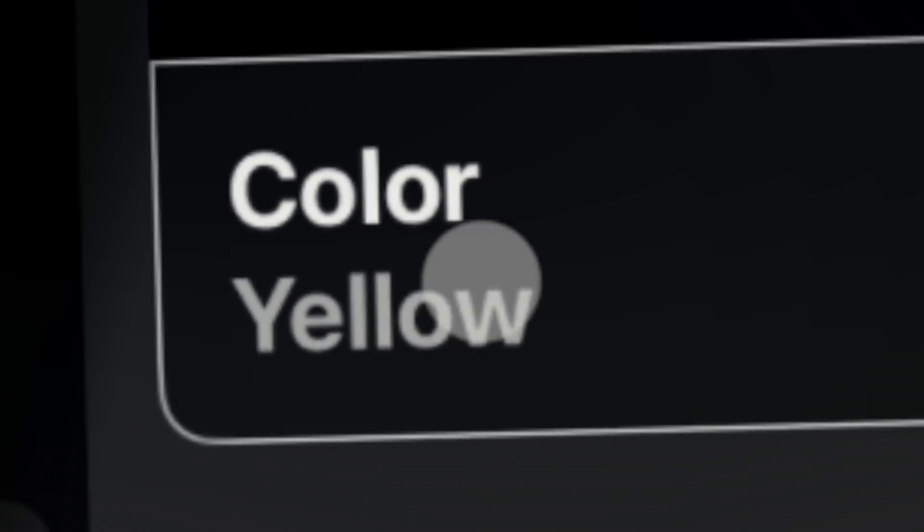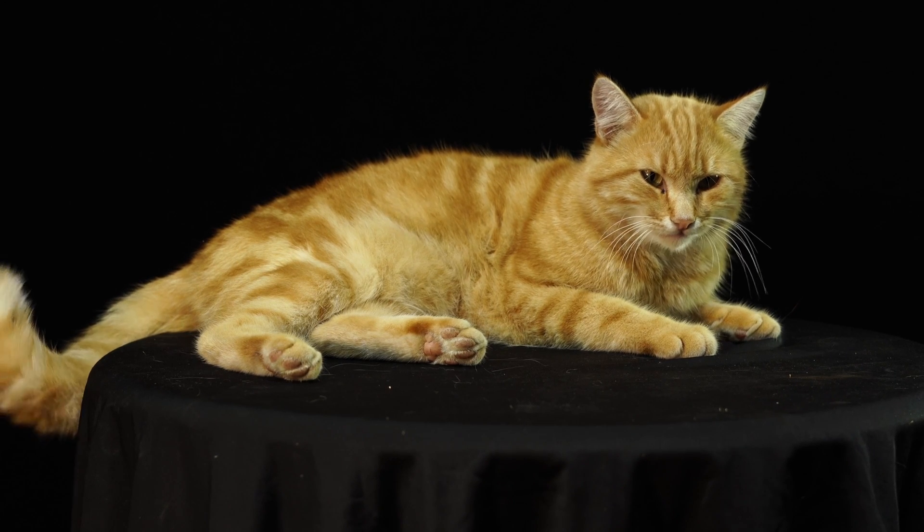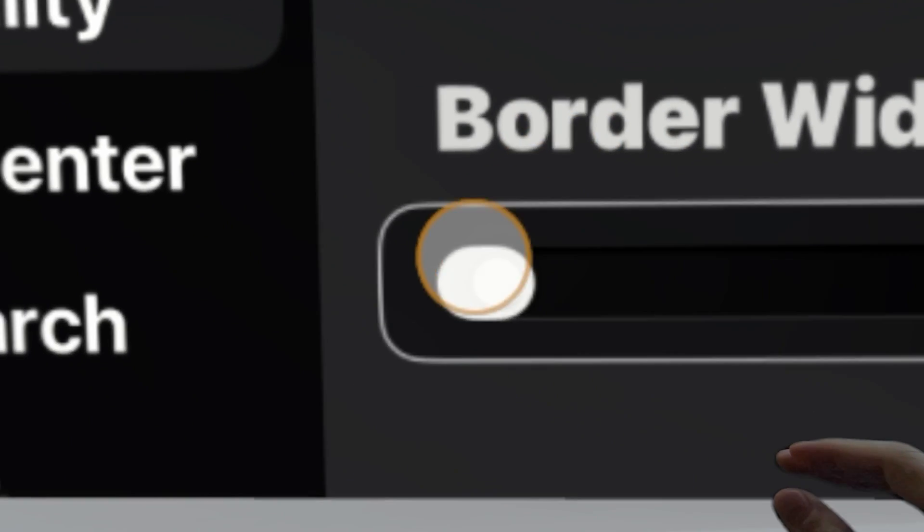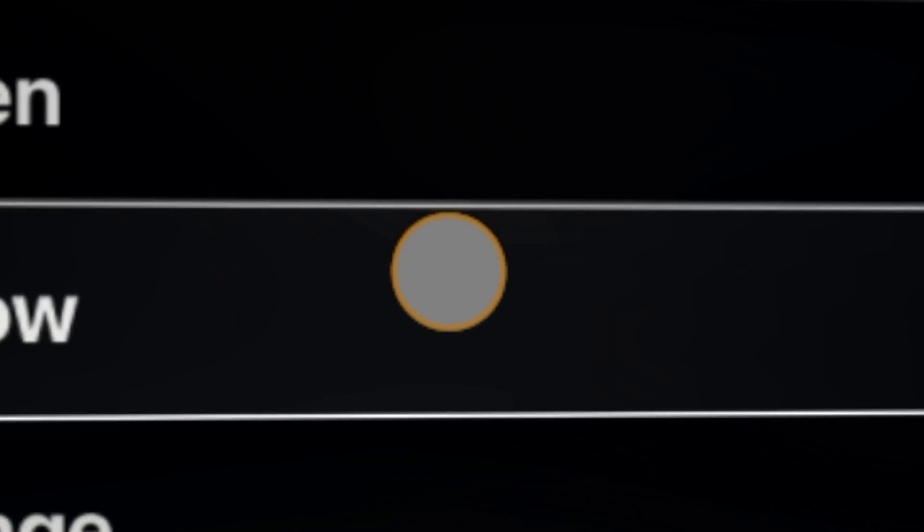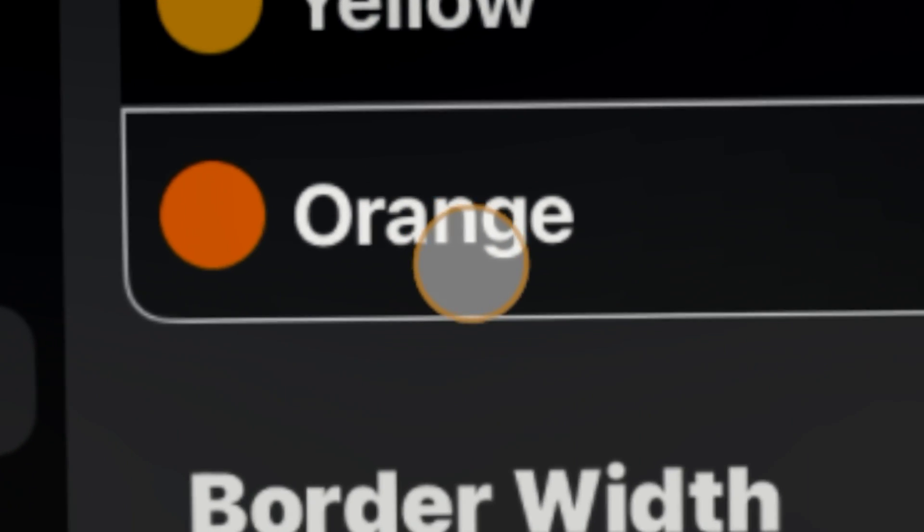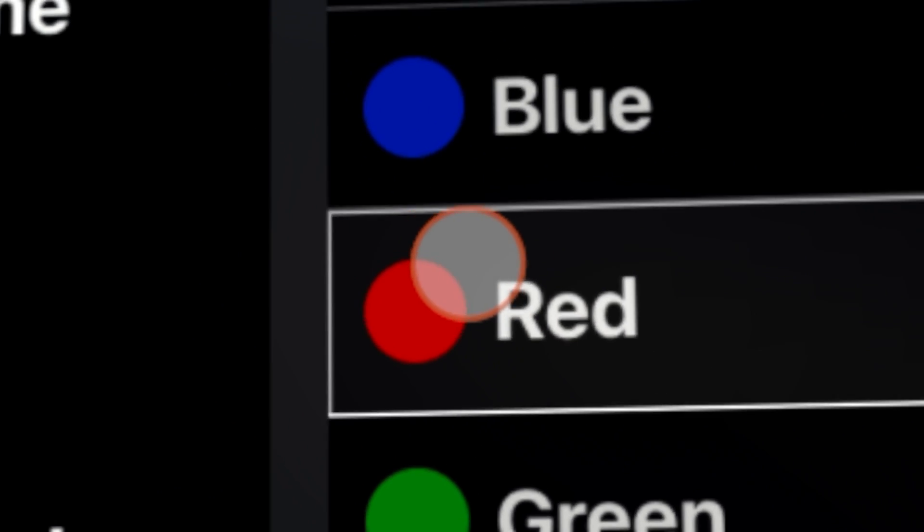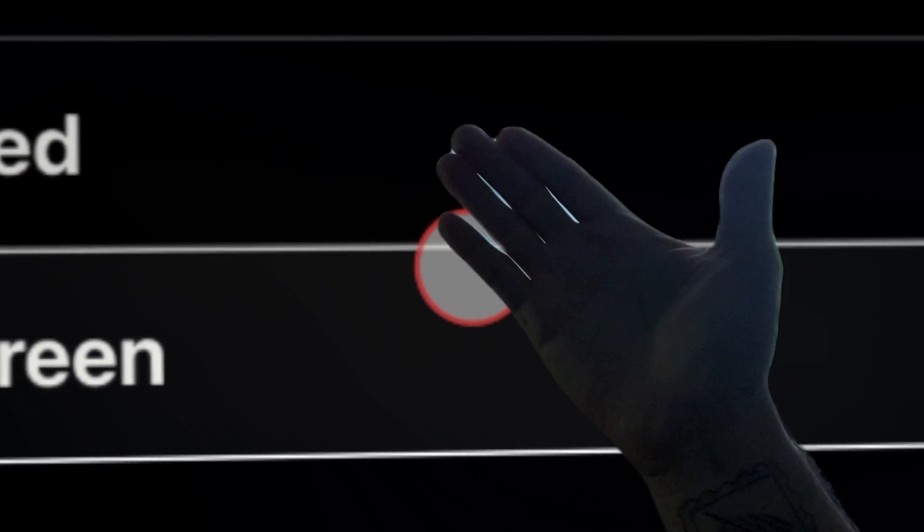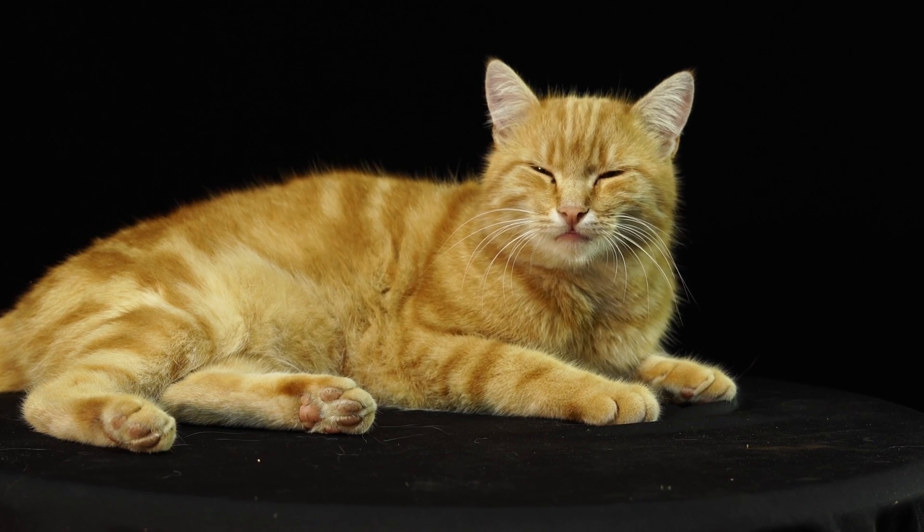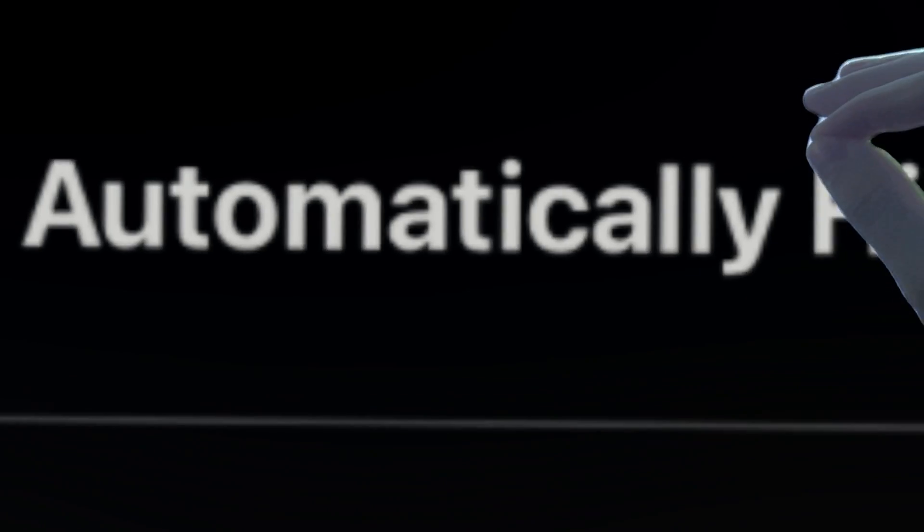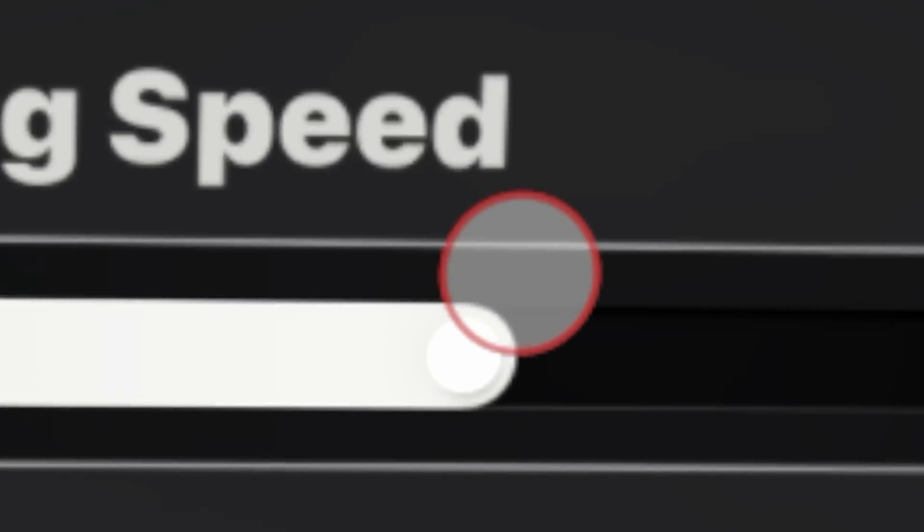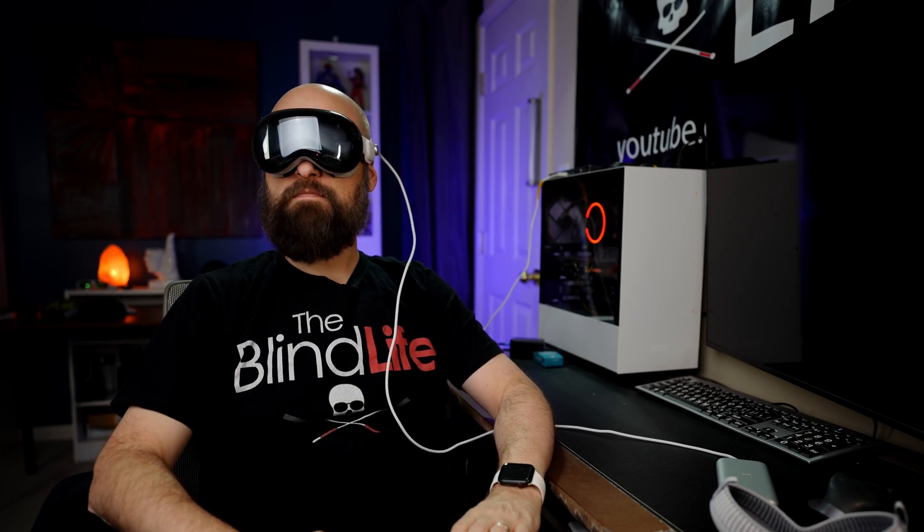That is choosing the pointer and how you want to actually use the pointer. Now you can come in here and you can change the color. I just wanted to clarify this little section here a little bit further. You have these options to adjust the color of the pointer. Your pointer is a large semi-transparent dot in the center of your vision, and surrounding that dot is a ring of color. So this is the color that you can adjust. Lots of different color options - reds, greens, blues, yellows, all of that. And then at the bottom, you have a slider to adjust the size of your colored border. I left mine kind of small, but you can make it much larger and more prominent. You can adjust the size of the pointer, and then how it functions with a trackpad, and then you can adjust the scrolling speed.